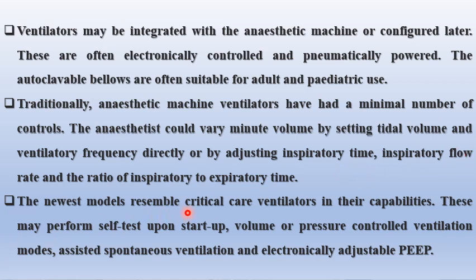The newest models resemble critical care ventilators in their capabilities. These may perform self-test upon startup, volume or pressure-controlled ventilation modes, assisted spontaneous ventilation, and electronically adjustable PEEP.